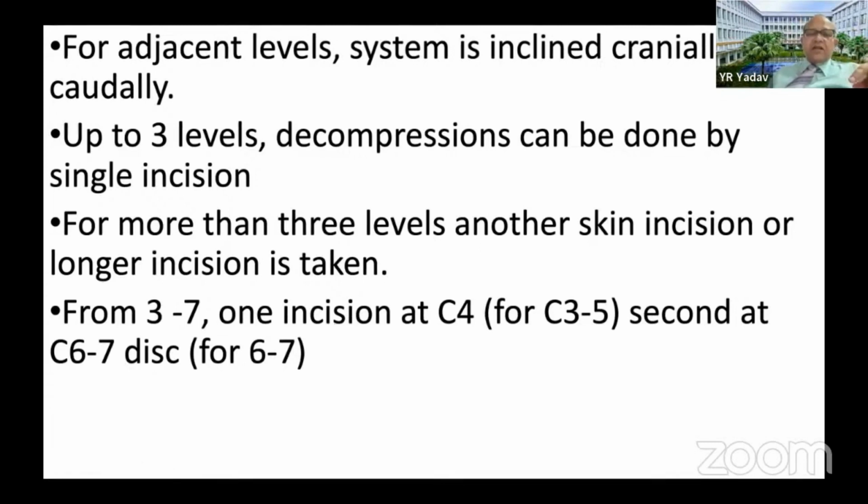another incision, because we don't have two tubular retractors. It takes about 15-20 minutes again. So it's better to have a single incision.